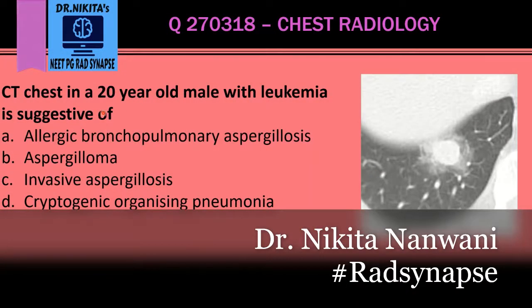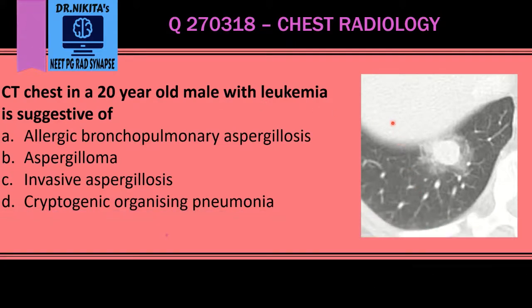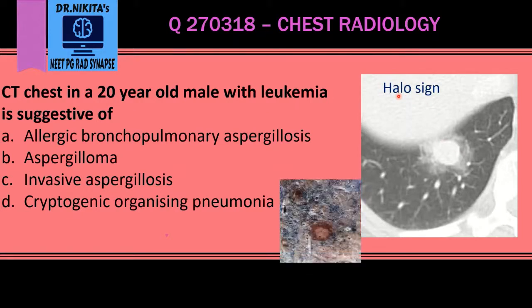Here we have a 20-year-old male with leukemia and a CT chest showing the classical halo sign. The halo sign is seen in invasive aspergillosis, where the fungus invades the vessels and thereby causes infarct in the lung. The central part represents the pulmonary infarct and the surrounding halo represents pulmonary hemorrhage. In angio-invasive aspergillosis, the central nodule or consolidation represents the infarct, and the surrounding ground glass opacity represents the pulmonary hemorrhage.